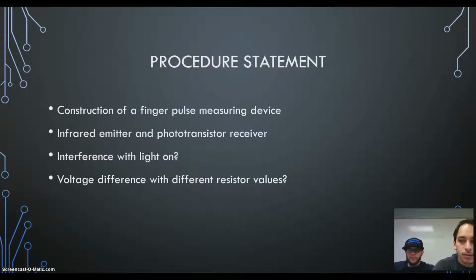In this experiment, we were tasked with constructing a finger pulse measuring device. Our device is incorporated using an infrared emitter along with a phototransistor receiver, which in turn will create an electrical output telling our 10 LED bar when to light up according to our pulse.